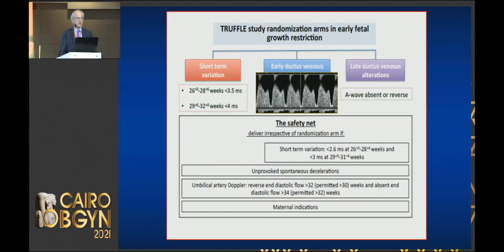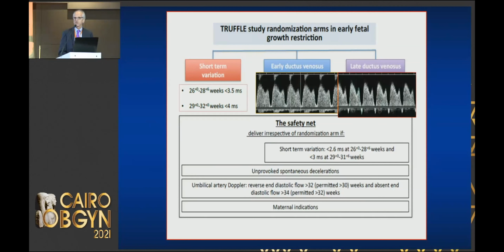Number 1 is the early fetal ductus venosus changes, which means an increased pulsatility, an increased PI value, but still positive flow during atrial contraction. Whereas the late ductus venosus group showed the most severe abnormality of the ductus venosus, which was zero flow or reversal of blood flow during atrial contraction.